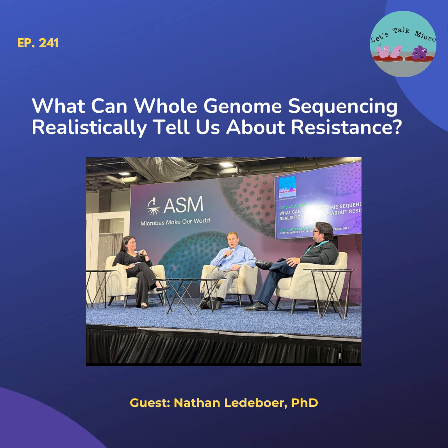So I think there's a lot of challenges when it comes to bringing gene sequencing into the lab. I think one of the things, if we harken back to the pandemic, that the pandemic really showed us in clinical microbiology is we have wholesale embraced automated molecular technology. We love our fully automated molecular testing systems, our sample-to-result testing systems. But as the pandemic showed us, when we didn't have test cartridges that were available, we forgot a little bit about the basics of how do we do molecular biology. In our laboratory, we started doing manual PCR testing, and our techs were like, what is this? Why are you making us do all of these extractions? And why do we see this contamination?